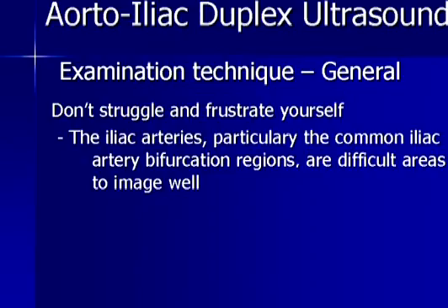in the abdominal study. The other thing to remember is this is technically a challenging and difficult study. Don't frustrate yourself during the course of the examination. If something is not working, go to the next part of the protocol and then come back to this at some point later during the course of the study.